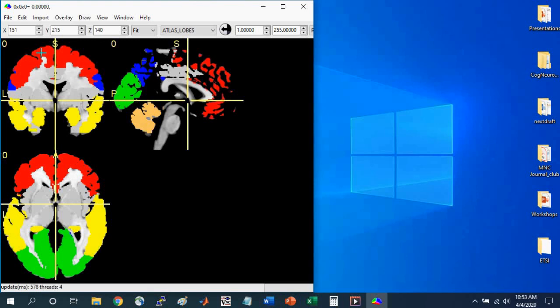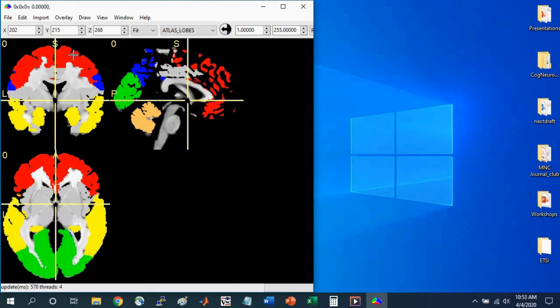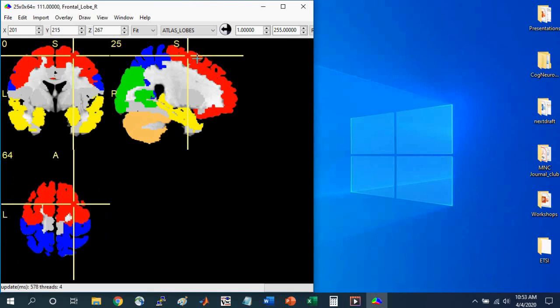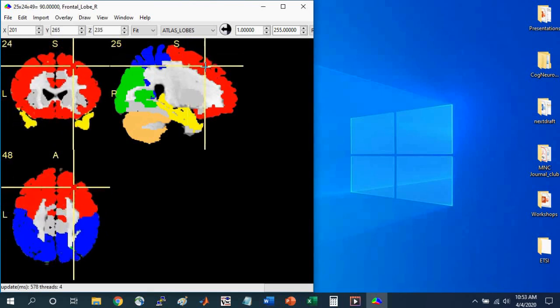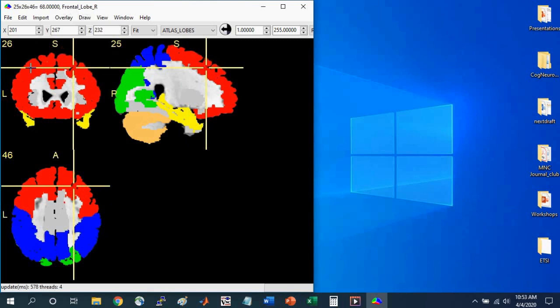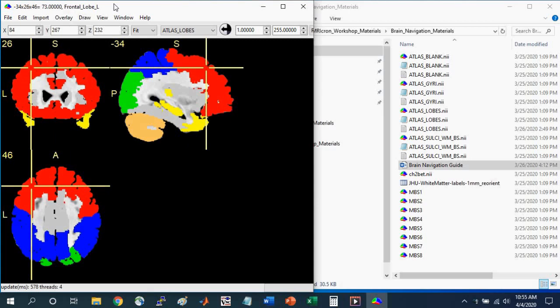You should see the colors show up in the different lobes of the brain. So if we click on the red area, so left click, here I've selected the frontal lobe, specifically the right frontal lobe. You can look up at the top where it gives the name of the structure. So frontal lobe underscore r. The r means right. If we click on the left, you can see that it changes to l.